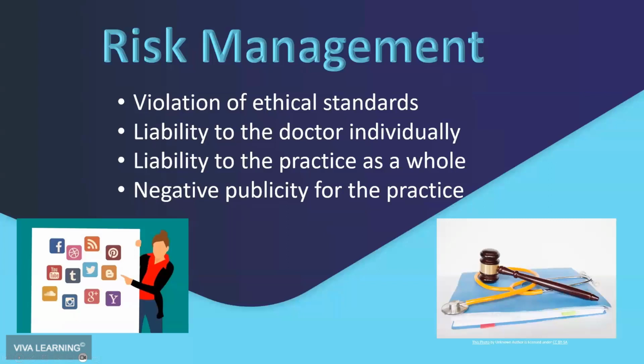And just to review those, that means the right temperature for the right amount of time, and that the steam in an autoclave is able to penetrate the packaging materials and contact the surface of the instruments in order for sterilization to occur. So not doing that is not following standard of care, which is a violation of ethical standards.